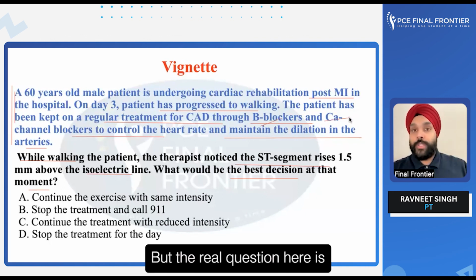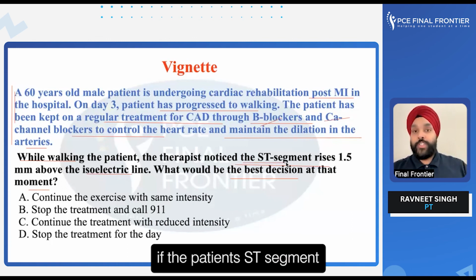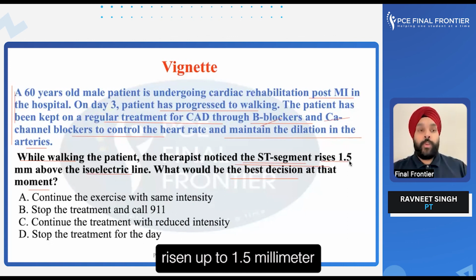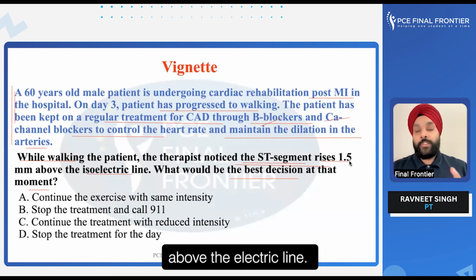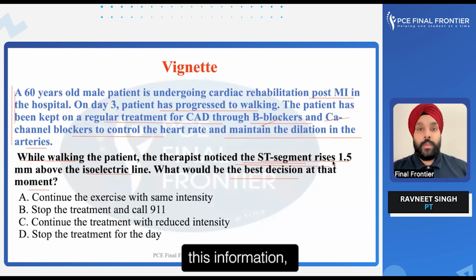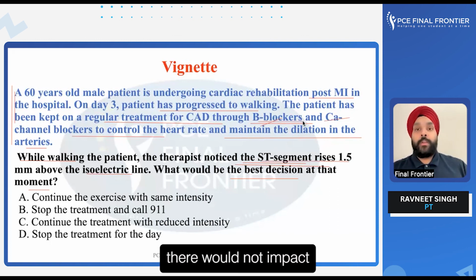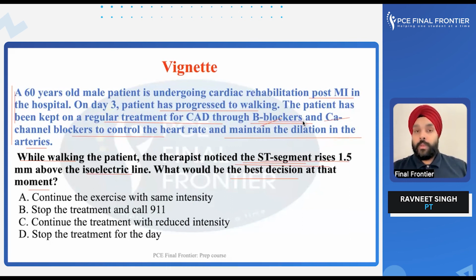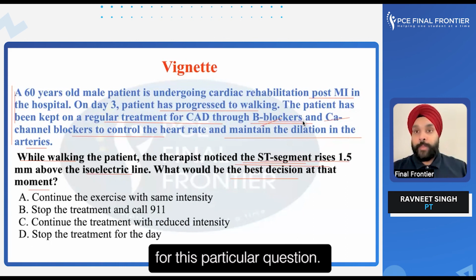But the real question here is, if the patient's ST segment has risen up to 1.5 millimeter above the isoelectric line. When you're given this information, whatever is given up there would not impact that information. This is not just the rule for this particular question.